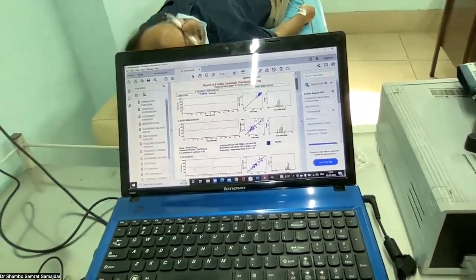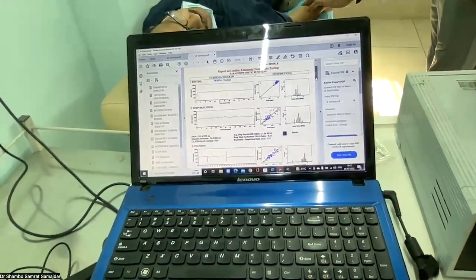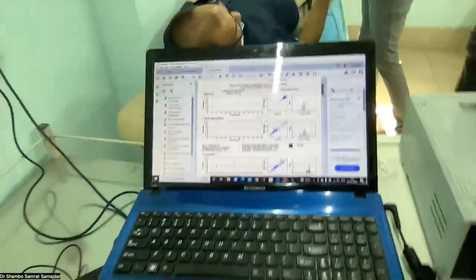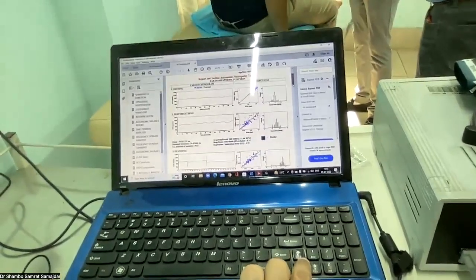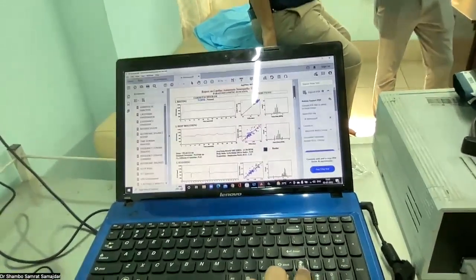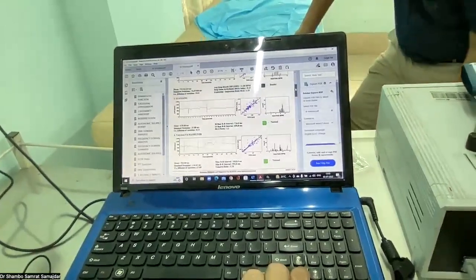Then what is the response to the deep breathing? And here we will find that the expiration inspiration ratio, which is 1.15, as per his age, we can denote it as a borderline thing. So there could be a borderline parasympathetic autonomic neurofunction deficit, but again we must appreciate maybe due to some technical issues and specifically the taking breathing without timing changes that may cause some errors. So what is again the standing response?